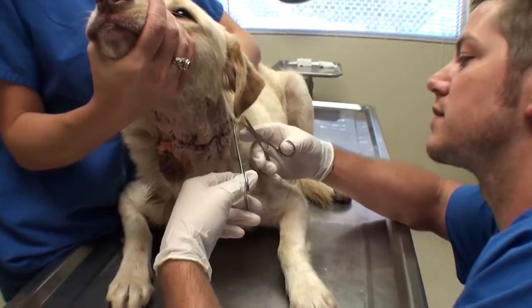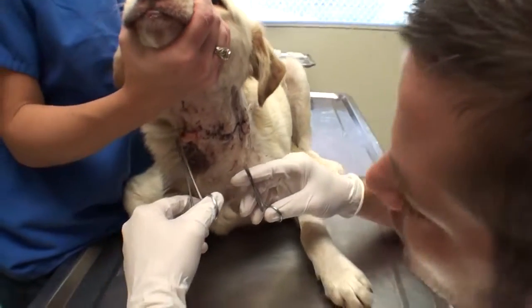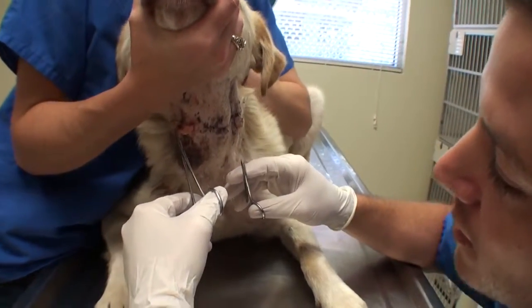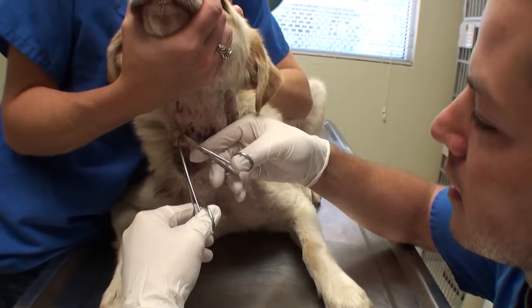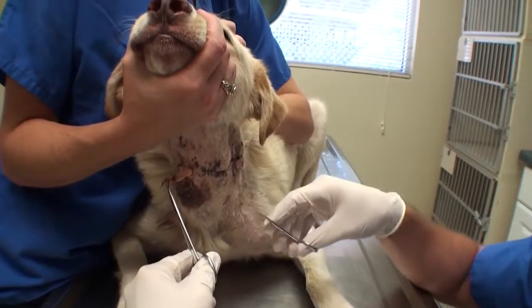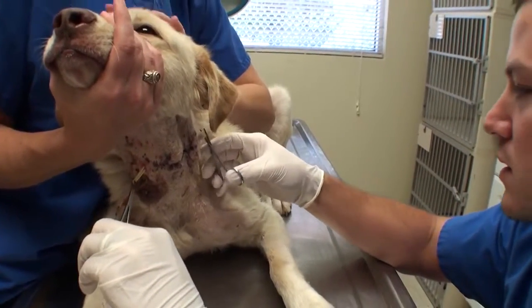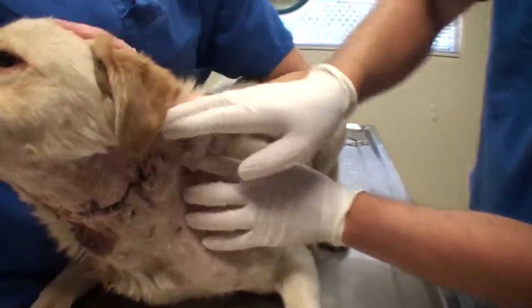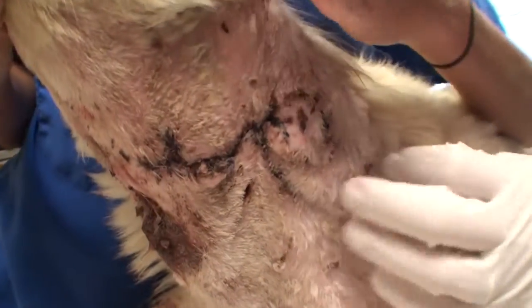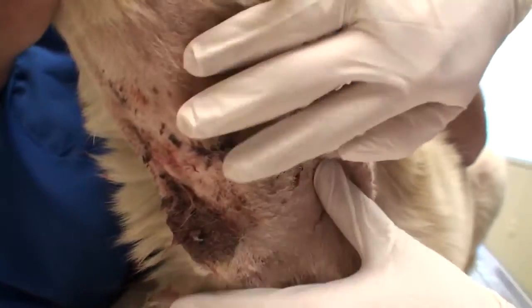It has been 4 days since we did his surgery, and I am pulling his drain tube out. It's still dripping a little bit, but not much anymore. So I'm going to pull it out so those holes can heal up, and he's actually doing really good. I get this one little stitch, and this is going to be kind of gross if you're squeamish. There it goes. You can see all these little scabs look a lot better than they did. They're slowly healing up, and I think this is all going to hold pretty well down here.